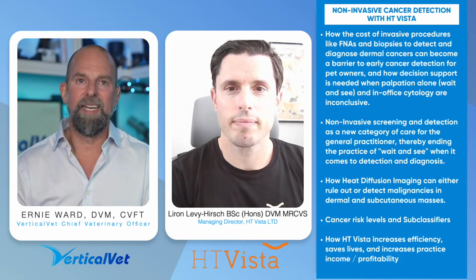Right. And again, this is a 40-second scan, guys. And let's just say for some reason you said, well, even though it's 98% negative predictive value, I don't agree with it. You now have more evidence, if you really choose to do so, to do an aspirate or biopsy or whatever. I just think this is fascinating.